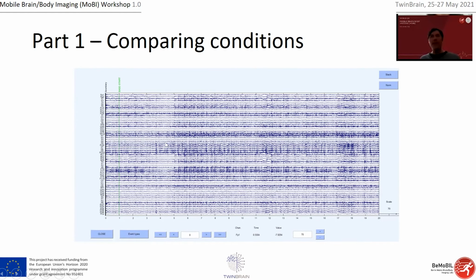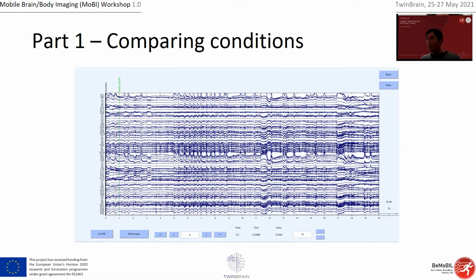I would also like to suggest, if you load data or get some data, or if you record yourself, I personally, after I think 10 years of EEG analysis, still scroll through the whole file every time. I think you can't be experienced enough to not look at your data. If you are a good coder, that's great. I try to be too. Some of us are trained as an engineer or even in computer science. I am too. But still, this is what you do. You look at the data, and you should.